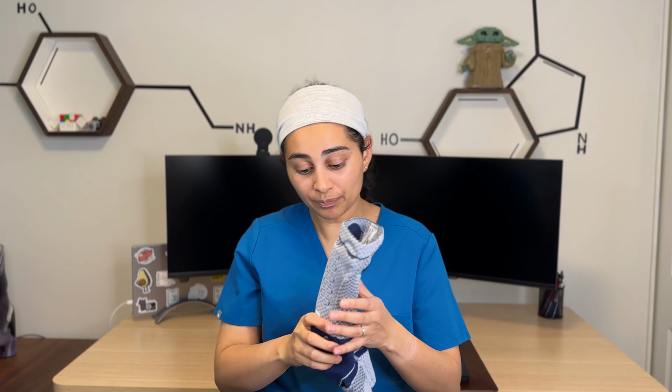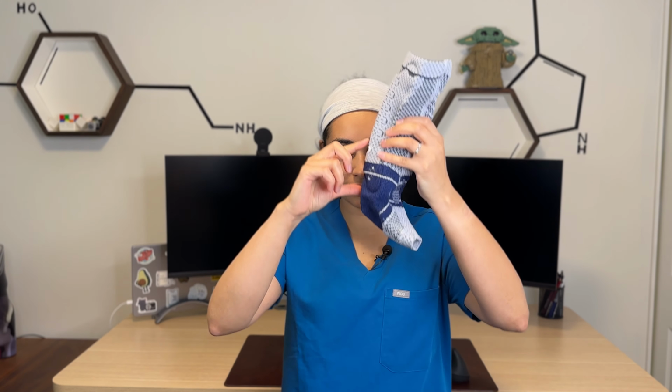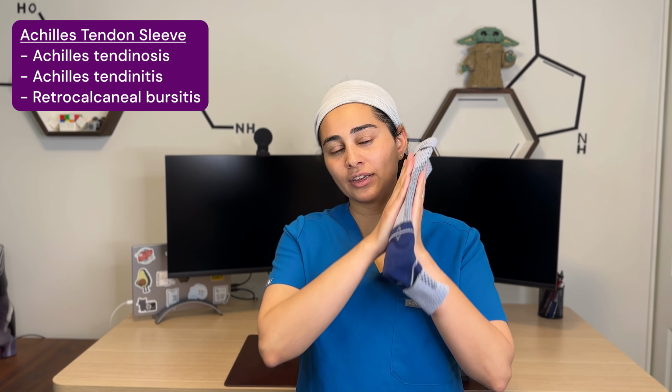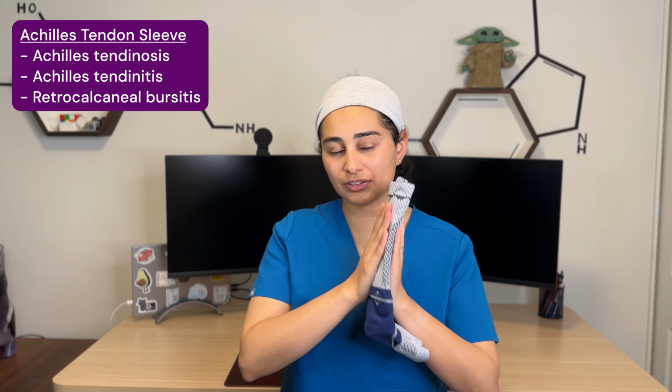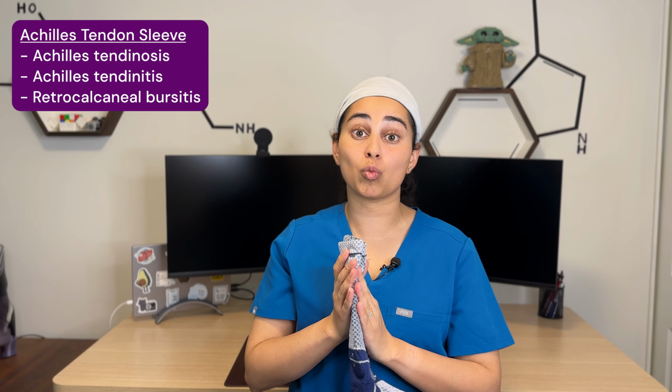This has got compression over the area that provides an added level of proprioception, but it also has some gel pads that will massage the tendon to provide some increased blood flow and relief. And then the last thing it does, with this heel lift, is lift up the back part of the heel so that the tendon is shortened and can offload to allow it to heal. So this can be quite effective. Think in your Achilles tendinosis or your Achilles tendonitis. I do not use this for Achilles tears. Achilles tears need a walking boot.